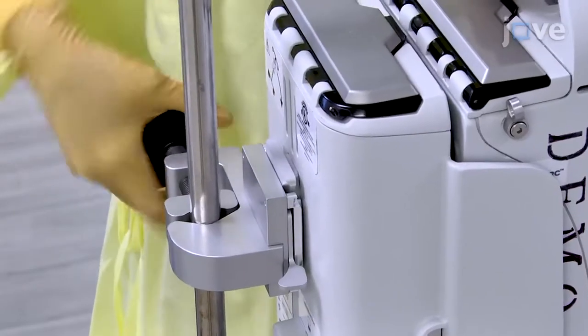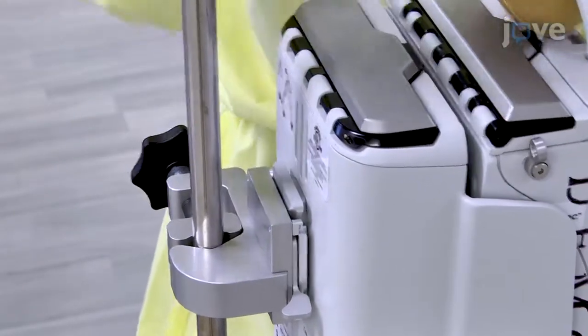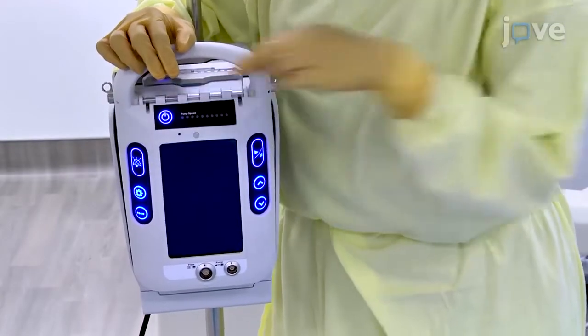Once done, use the clamp to mount the dock and controller on an intravenous pole, and operate the buttons on the side to turn on the controller.